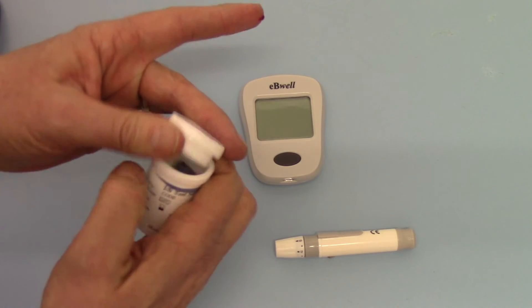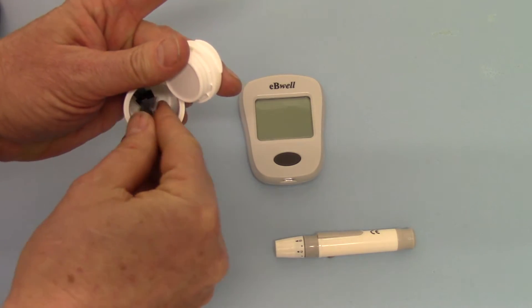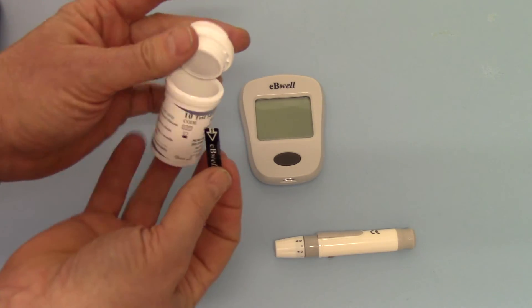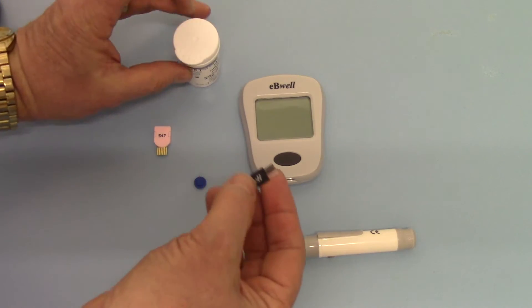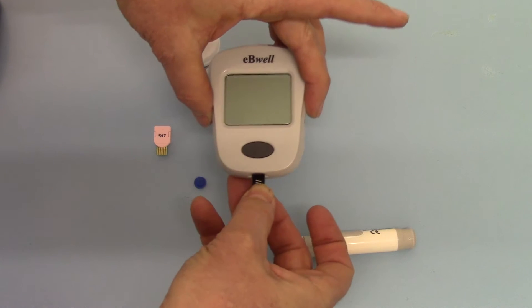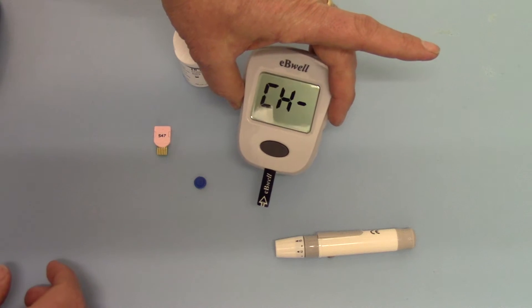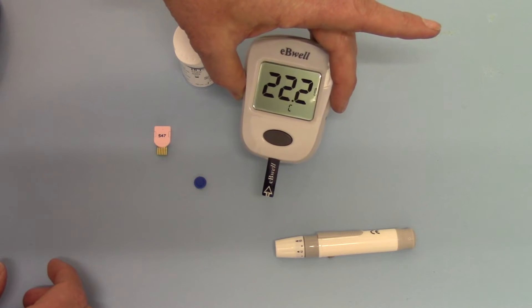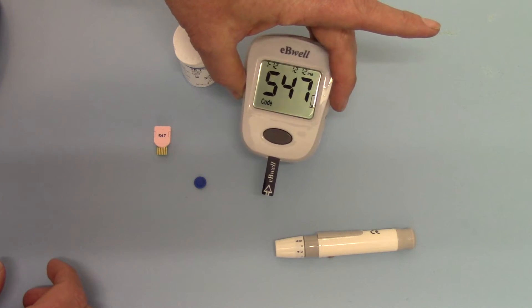So let's take a test strip out. Here we have one of the Ebewell test strips. This inserts into the base of the meter which will power up and show the temperature and the test batch code chip number.